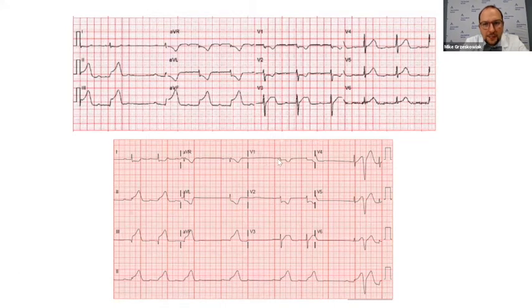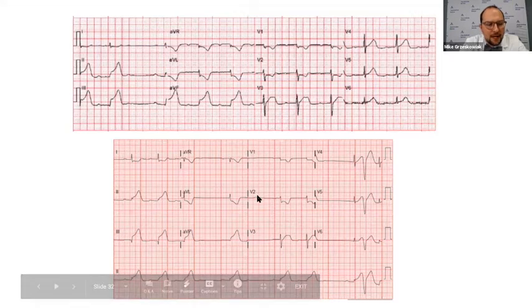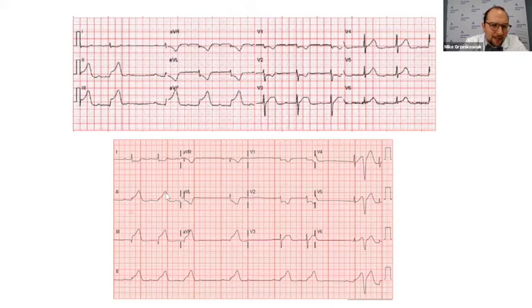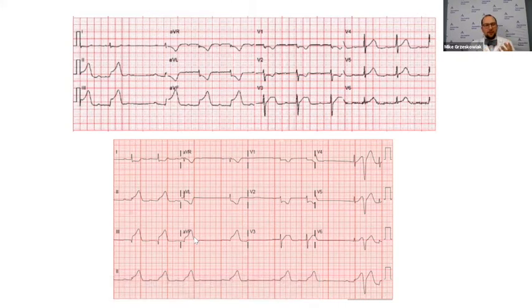Moving to V1, we see some ST depressions. Moving to V2, we have some more ST depressions, but then V3 — we don't see any more ST depressions. So they're isolated to V1 and V2. If you have isolated ST depressions in V1 and V2, you're thinking that the posterior wall is involved, especially if you have ST elevations in II, III, and aVF. Because the right coronary artery supplies the right ventricle, which is also that posterior wall.